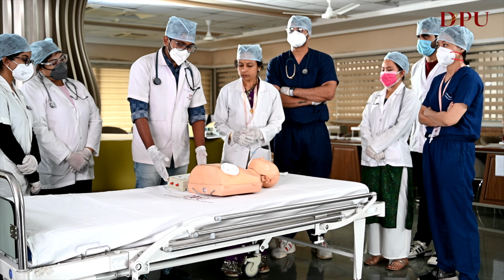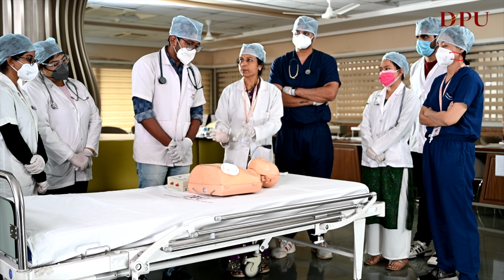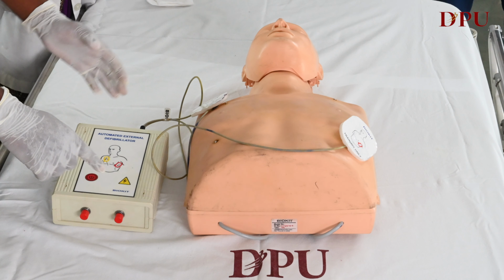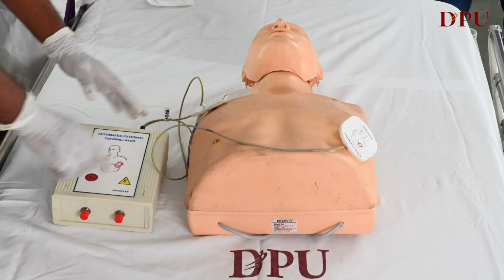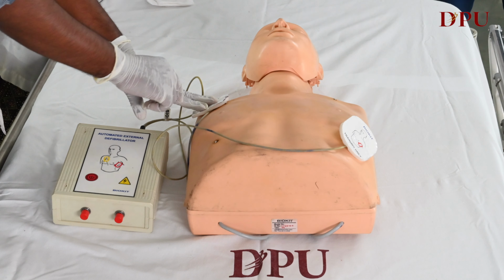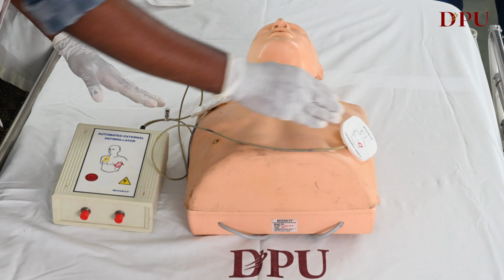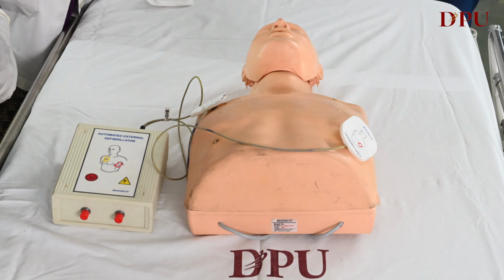This is an AED machine. So the AED has come, and the chest compressions are going on. You came up with the AED. First, power on. Then the electrodes are put on the right infraclavicular region and on the apex. You can see in the drawing where it is to be fixed.